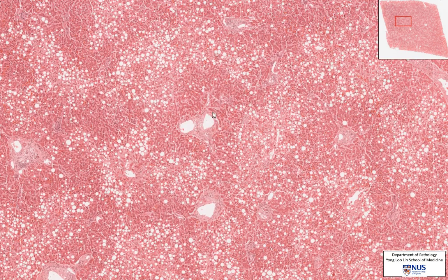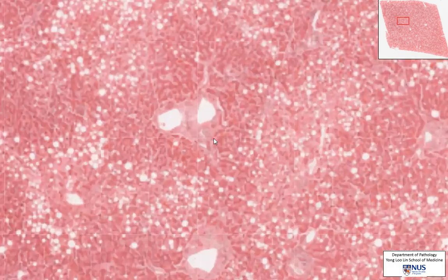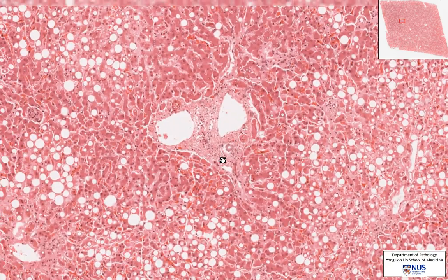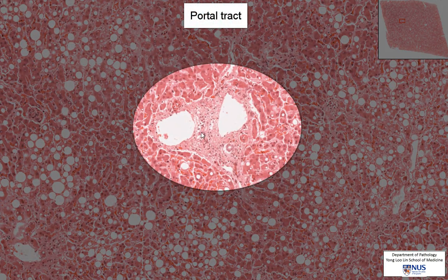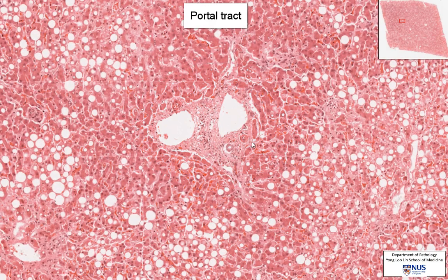If you look at this, there is actually a portal tract in the center of this darker pink region. How do I know it's a portal tract? It has the portal vein, it has a bile duct, and it has a hepatic artery branch. There's also some mesenchymal tissue, connective tissue around this, and this together makes up the portal tract.